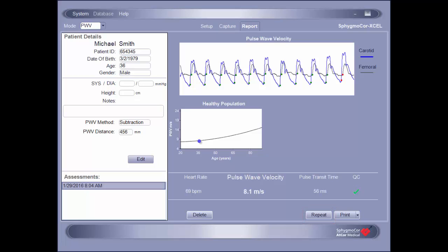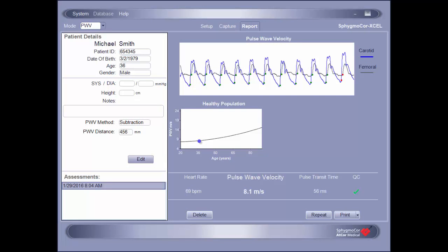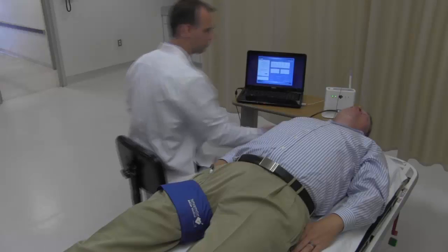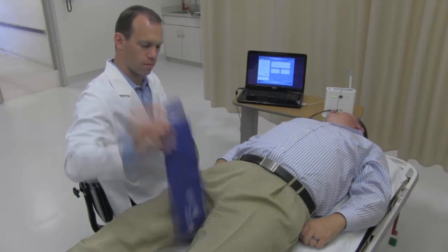Once generated, a report is automatically saved to the patient's profile. Any subsequent reports will also be added under the patient's profile and can be accessed in the Assessments section. All reports are listed chronologically and identified by the date and time of the assessment. If the computer has been configured with a printer, it is possible to print a hard copy of the report by clicking the Print button in the lower right-hand corner of the screen. Once an acceptable report is obtained, pulse wave velocity is complete and the cuff can be removed.